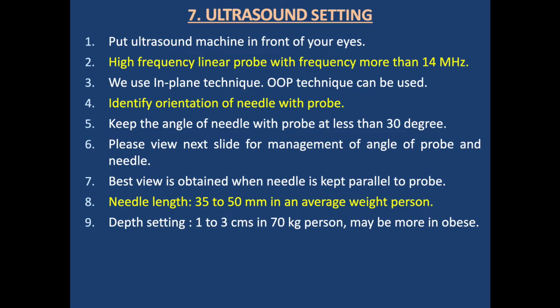We use a high frequency linear probe with frequency more than 14 MHz. We use the in-plane technique. The out-of-plane technique may also be used because this is an interfacial compartment block. We identify the orientation of the needle and probe. We keep the angle of the needle with the probe at less than 30 degrees. Please view the next slide for management of the angle of the probe and needle.